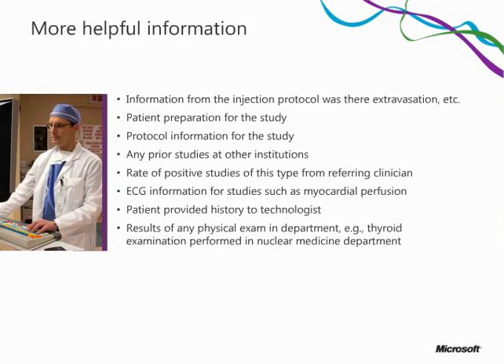Information from an injection protocol. Was there extravasation that I need to dictate? Can I get information from a smart contrast injector? Patient preparation for the study, protocoling information, previous studies at other institutions, ECG information, information provided by the patient to the technologist, results of a physical exam such as a thyroid examination that was performed, for example, in the nuclear medicine department. All of those would be really helpful for me.